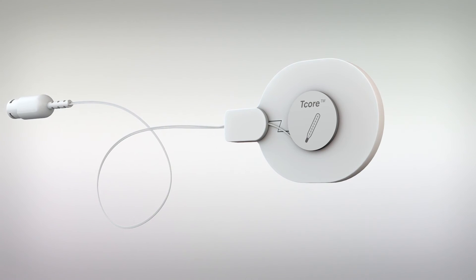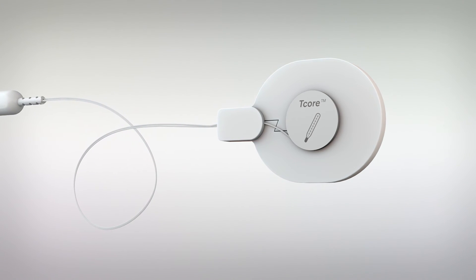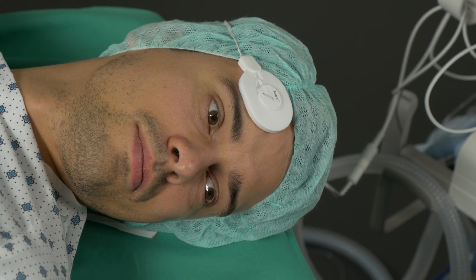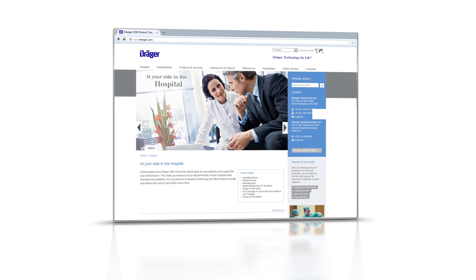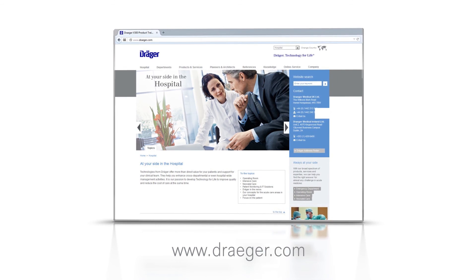Discover T-core now as a non-invasive alternative to previous invasive standard measurements of the core body temperature — for children 5 years and older and adults. Ask your Dräger sales personnel for a demonstration of this innovative system. Please refer to the instructions for use and our website www.draeger.com for more information.